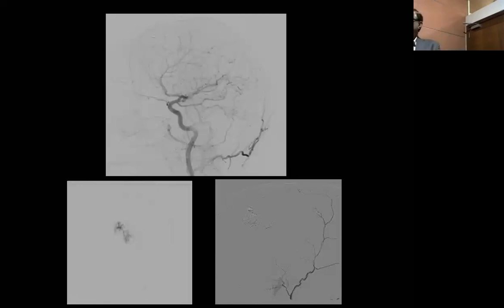How can you judge that you decreased the blood supply by 70%? You either calculate from the volumetric parenchymogram and see how much you reduced the parenchymal enhancement on the last image that you take, or you examine the volume of the brain itself, how much you decreased the supply by volume.